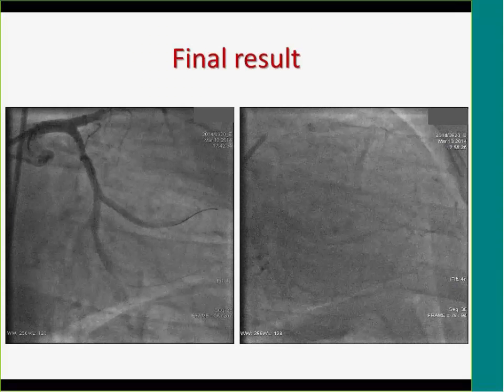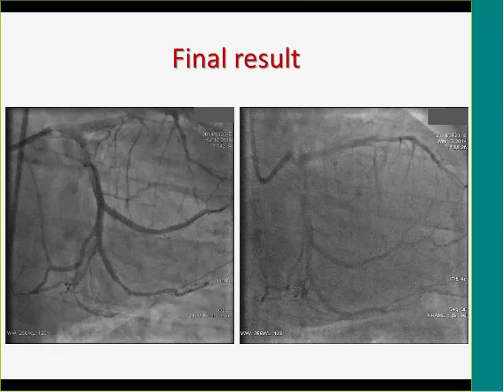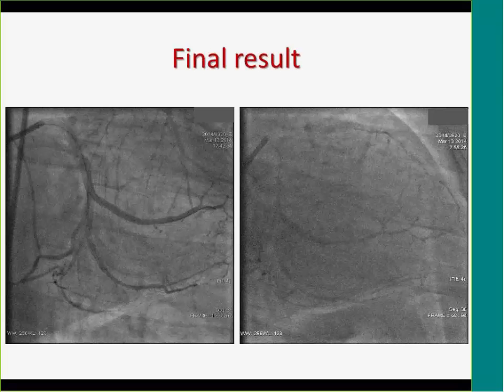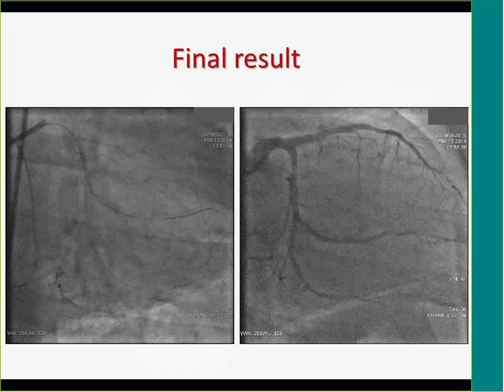So on the right angio, we can see the final result of this procedure, after which the patient had a good clinical follow-up.